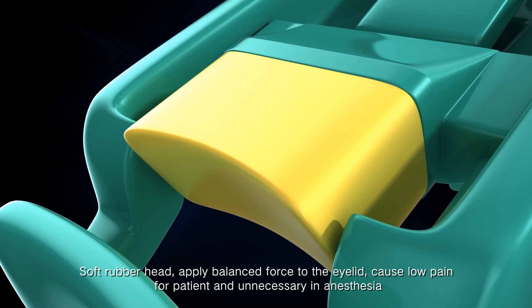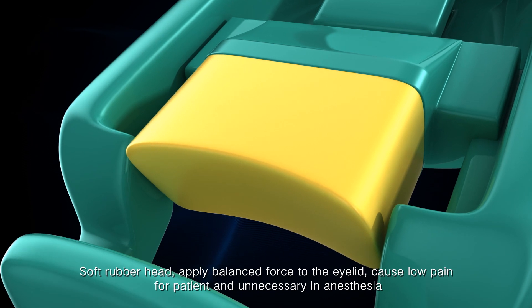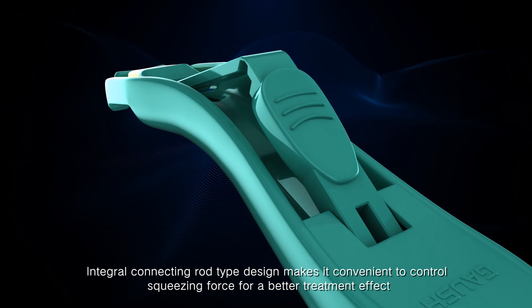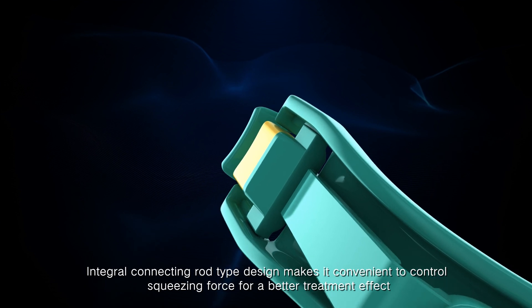The soft rubber head applies balanced force to the eyelid, causing low pain for the patient and eliminating the need for unnecessary anesthesia. The integral connecting rod design makes it convenient to control squeezing force for a better treatment effect.